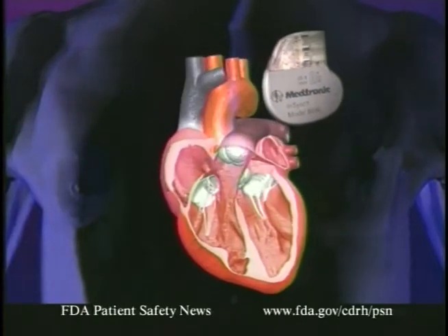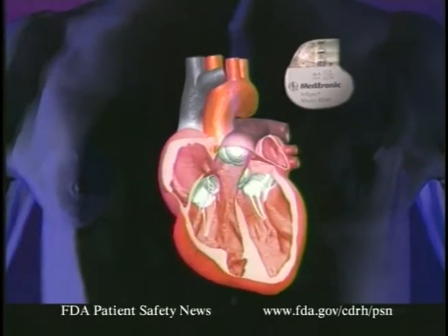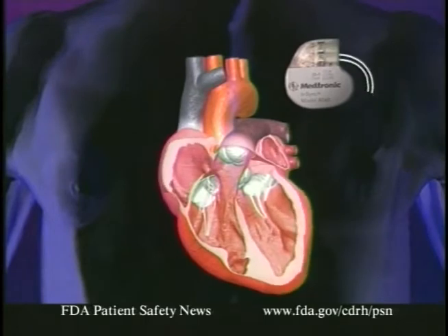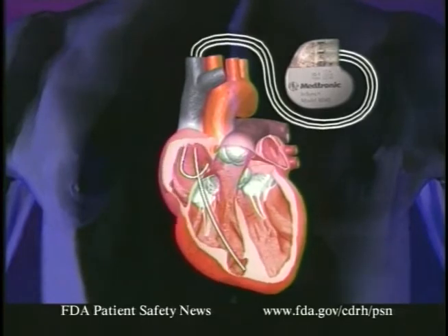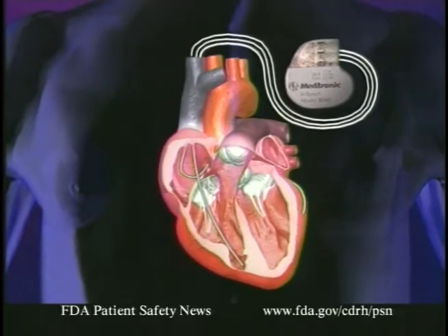The system includes a pulse generator implanted in the patient's chest, which is connected to three lead wires that deliver the electrical impulses. One lead goes to the right atrium, the other two are placed in each of the ventricles, where they stimulate those chambers to beat simultaneously.